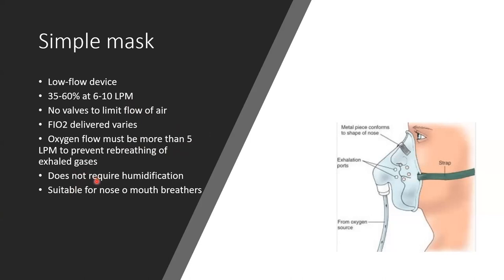5 liters per minute. You cannot apply a face mask to a patient if the flow rate is less than 5 liters per minute. The reason is the carbon dioxide will be trapped over here, and therefore the patient will be breathing carbon dioxide instead of breathing oxygen. Yes, Pierre, that is correct.